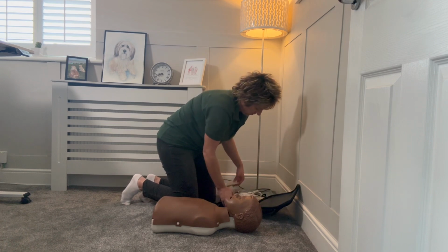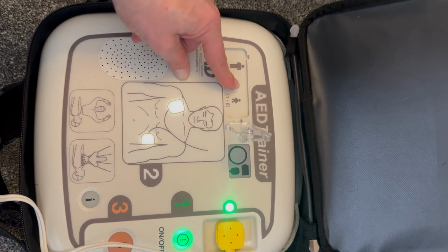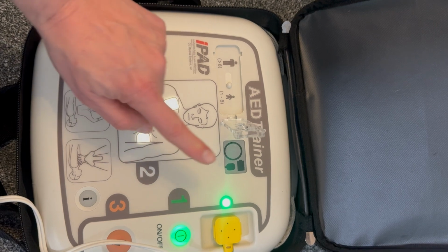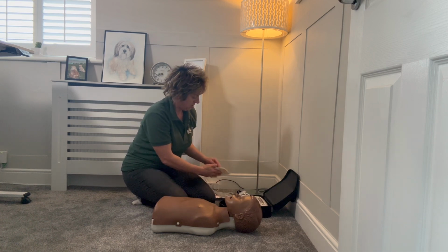Now, the first thing we're going to do is turn the defibrillator on. Then we also need to change the setting. Some defibrillators have this function, some don't. But if yours does have a function and you've got somebody under 8, which is roughly under 25 kilograms, you're going to change the switch to pediatric mode. If you haven't got that switch, do not worry. Then we're going to place the pads on the casualty.